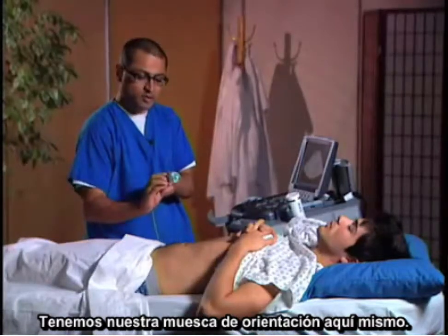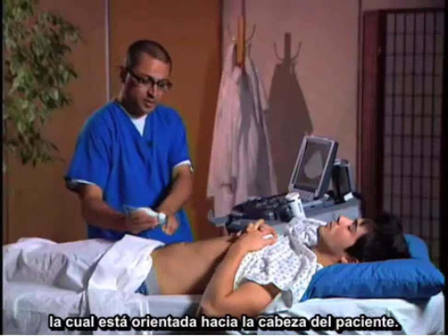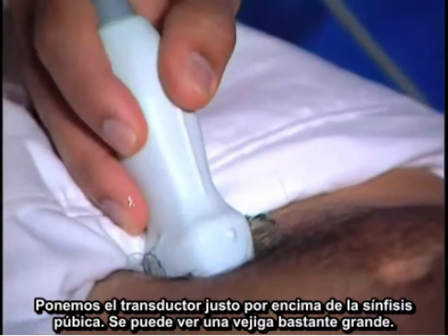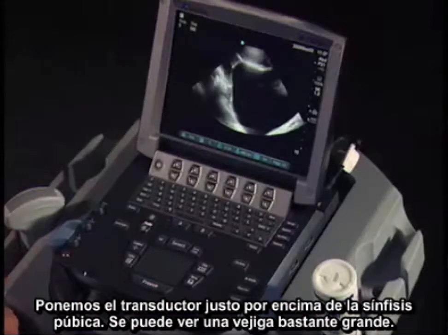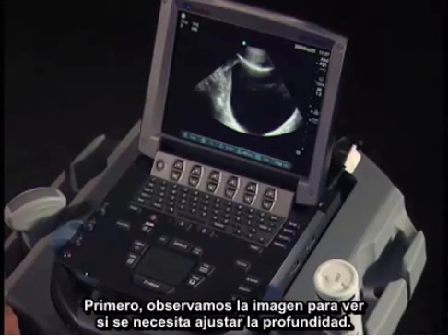We have our marker right here. That's going to be aiming toward the patient's head, and we're going to put this transducer just above the symphysis pubis, and we're going to see the bladder. We can see a pretty large bladder here.